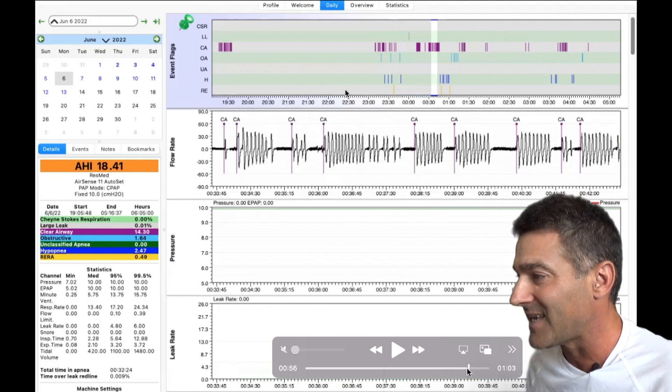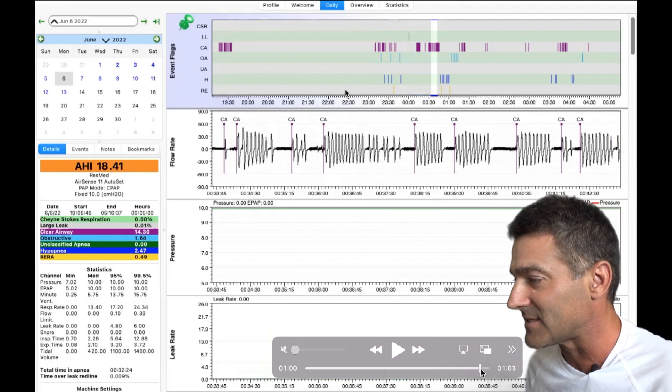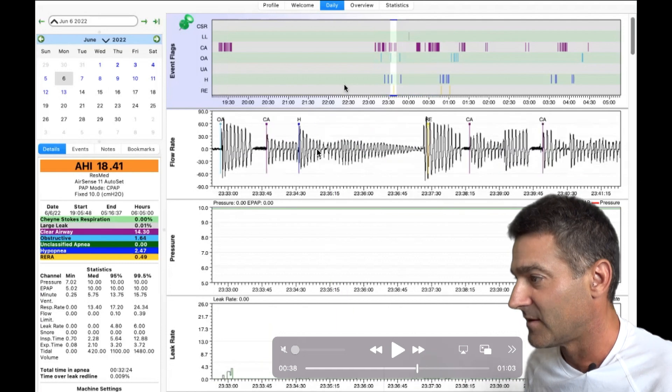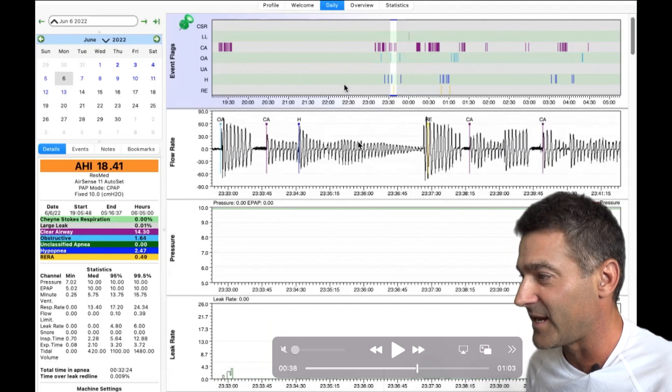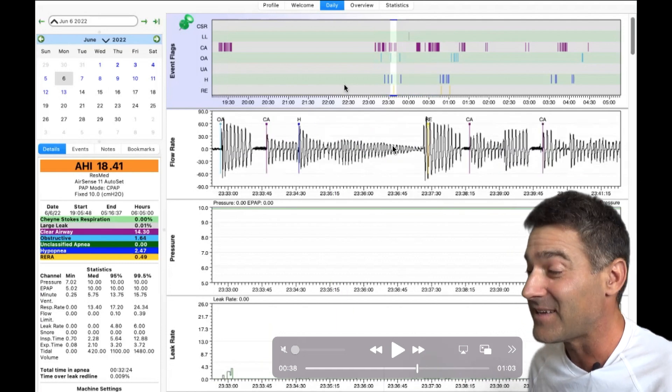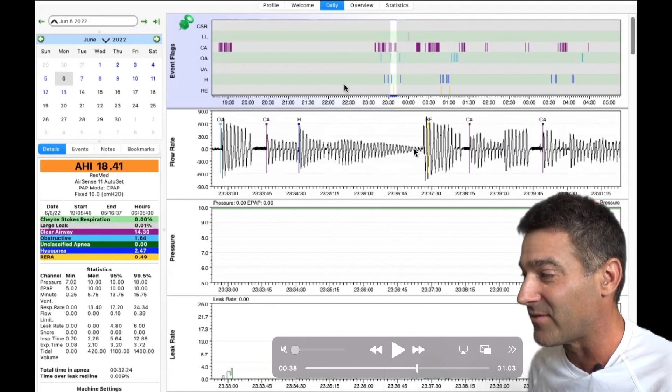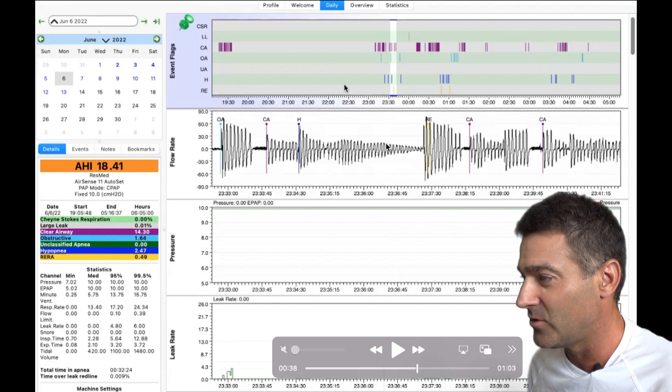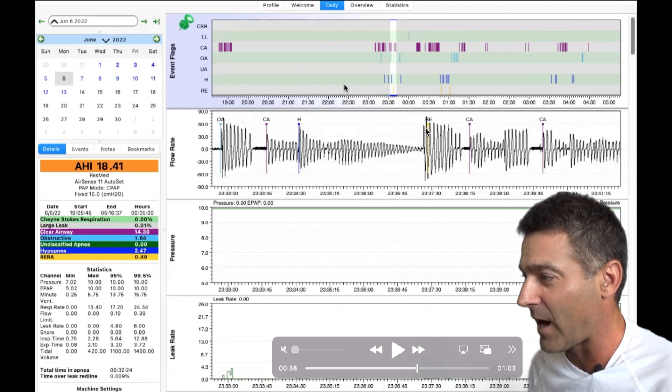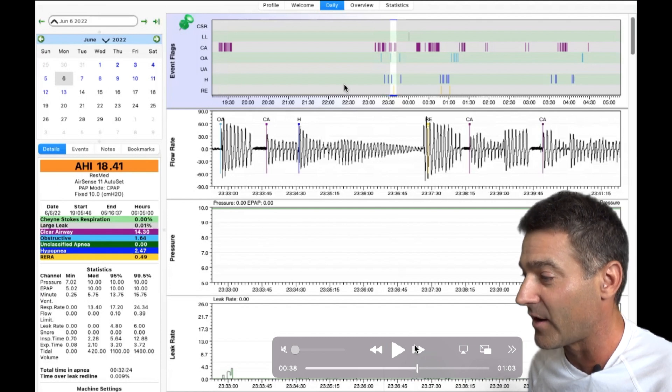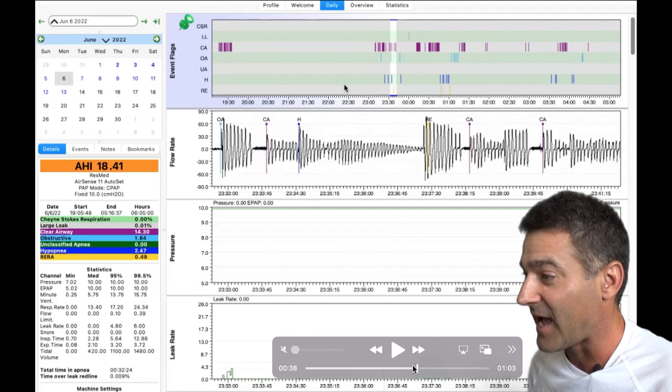The reason we had to lay on the side is look at this. We go forward a little bit. Look at this guy right here. Look at that. That is a massive hypopnea. Slow decrease, slow decrease, slow decrease, rapid increase.